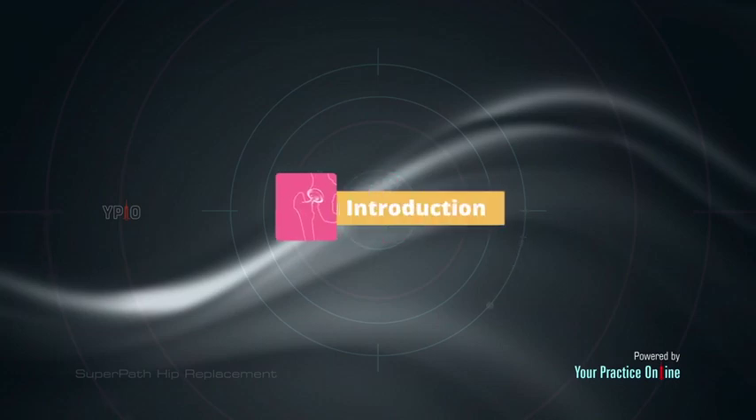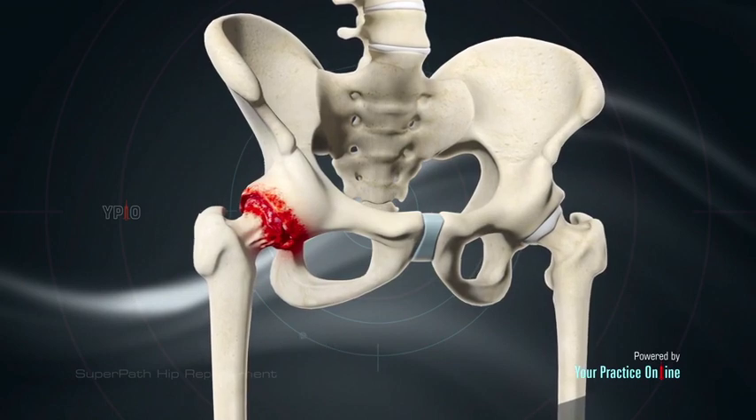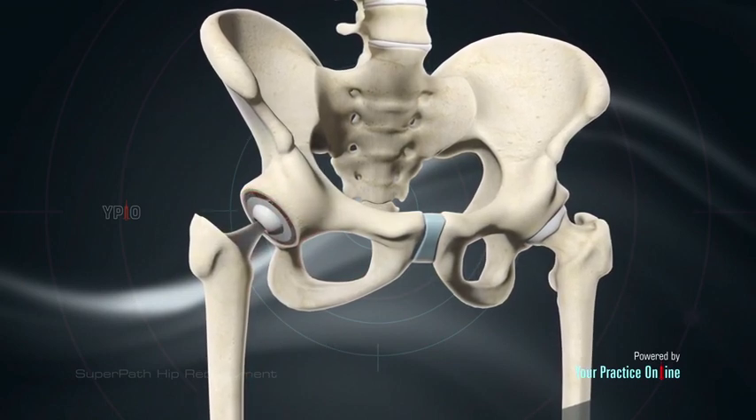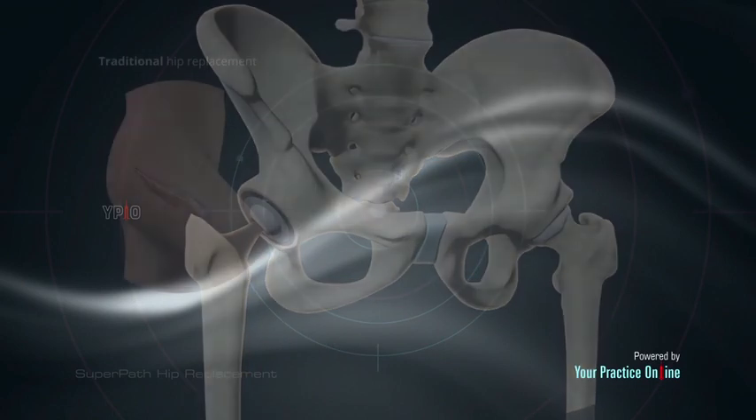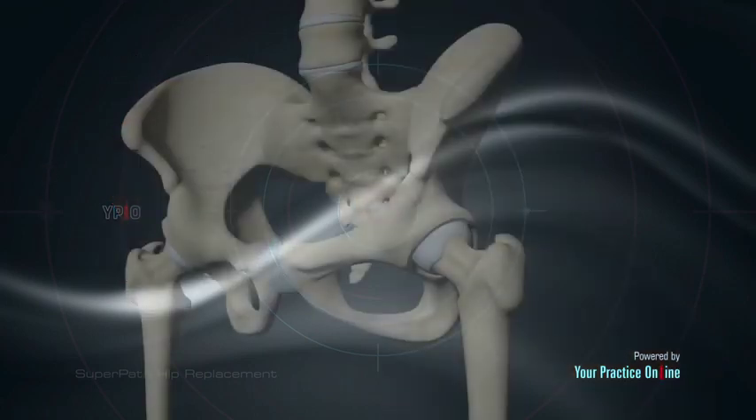Introduction: Super path hip replacement is a surgical technique performed to replace a diseased or arthritic hip joint. It has certain benefits over traditional hip replacement surgery as it uses a different approach to minimize tissue injury.